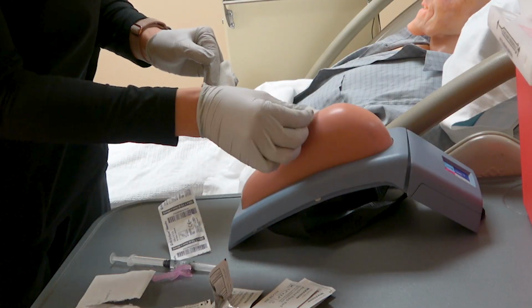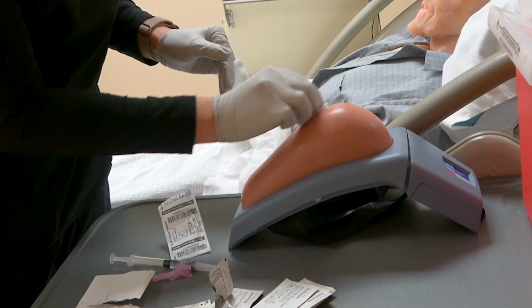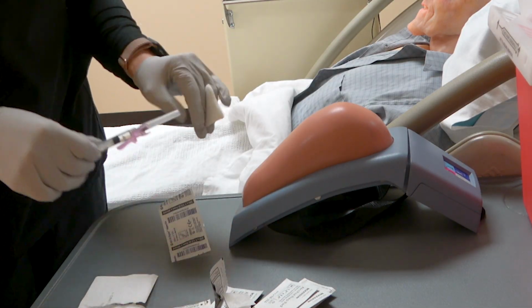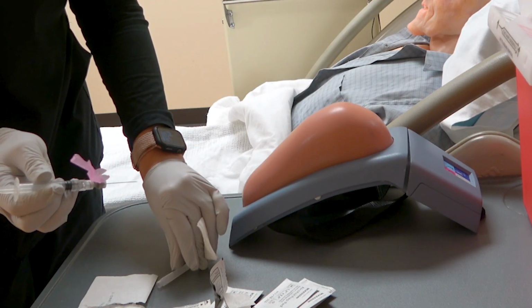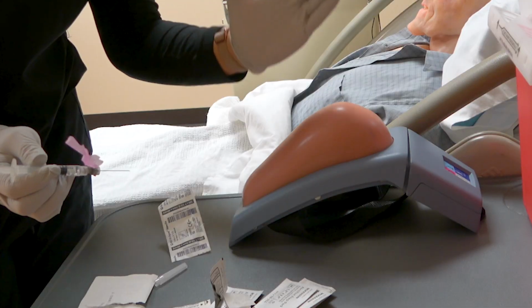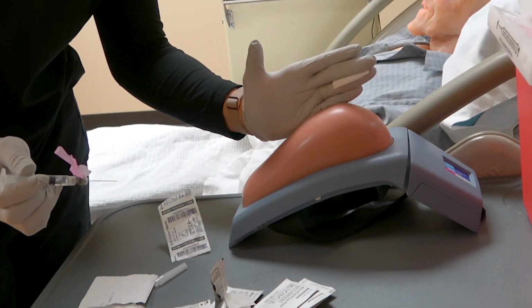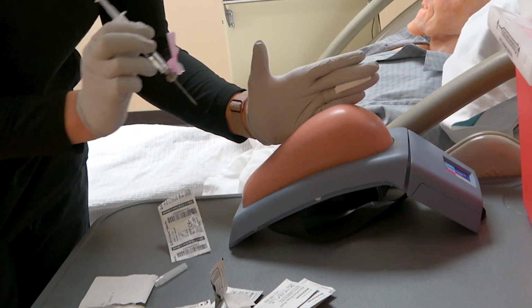Now we're going to clean our area. We're giving this in the deltoid. So we're going to clean that area in a circular motion all the way out, and then we're going to let that air dry. Once that has air dried, we're going to take our cap off of our needle, and we're going to use the Z-track method. So we're going to use the ulnar side of our hand, which is the pinky side, and we're going to go right next to where we want to give that injection. We're going to place our pinky side over, and we're going to stretch that skin taut. And this is called the Z-track method.